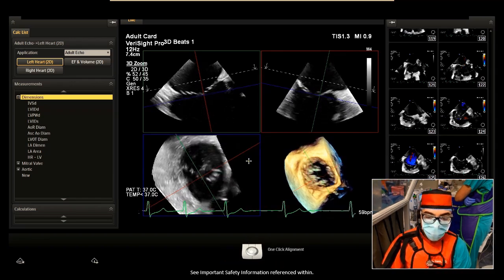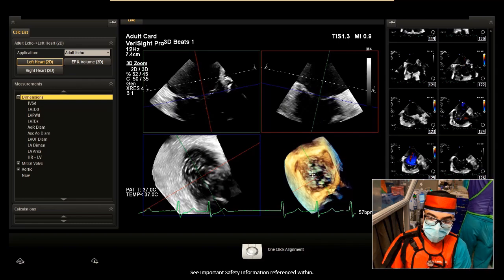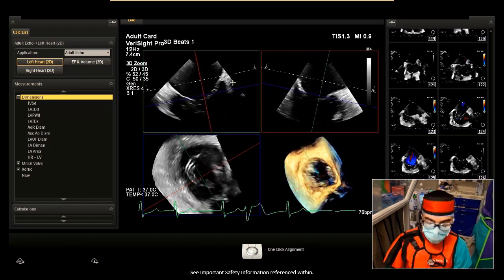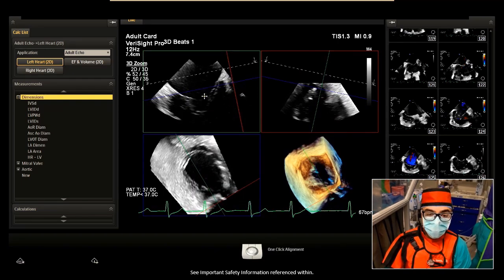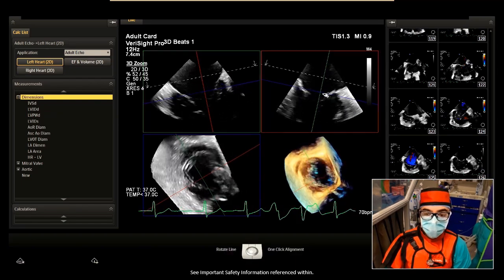Sometimes when you're looking at 3D ice, you can look at the 3D rendering. You see that septal leaflet there, anterior leaflet here, posterior. If you want to confirm aorta location, you just right-click up here where you know the aorta is. You can see the crosshairs and the 3D ice jump right there. So aorta is at 5 o'clock, exactly where we'd like it to be. I'll right-click back so the blue plane is cutting the leaflet tips again.